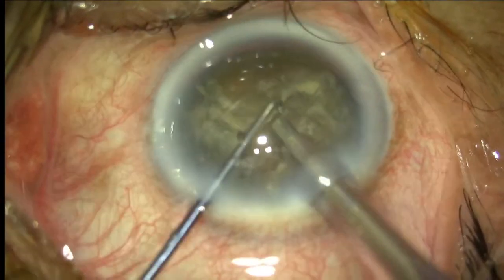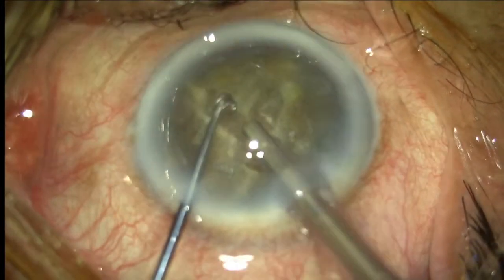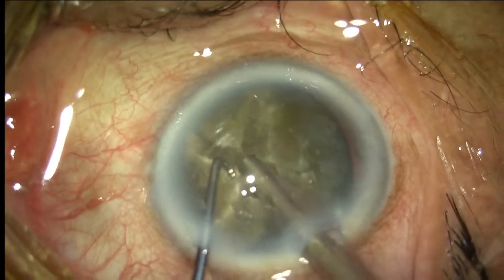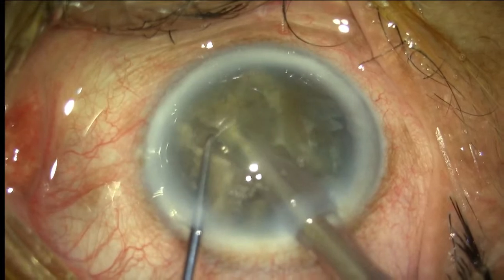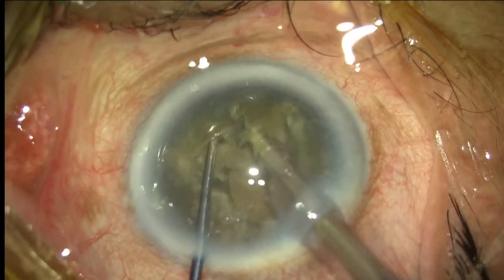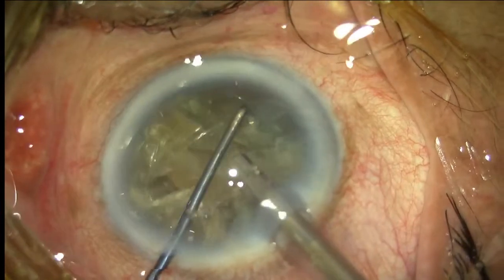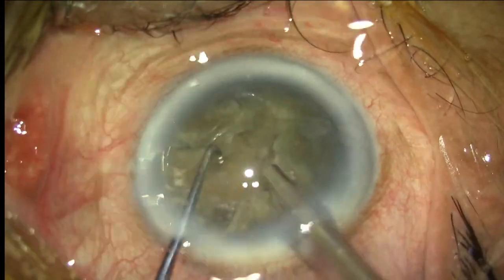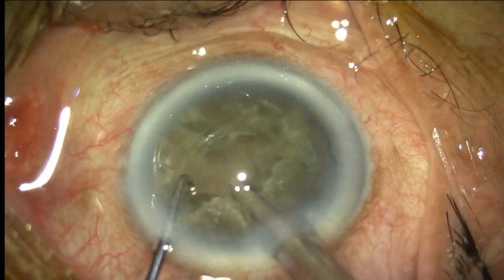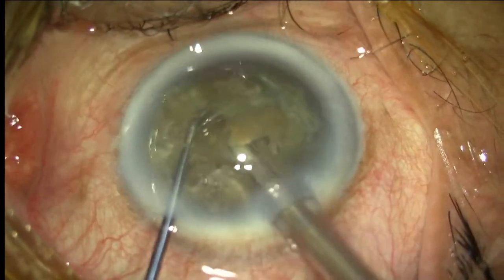So sometimes you have to go around and try to do the chop at multiple places. Very hard. This one is a very hard nucleus. Now you see the endonucleus is almost like a ball here. You can see this. So I'll take the endonucleus first, just complete the emulsification of this one.